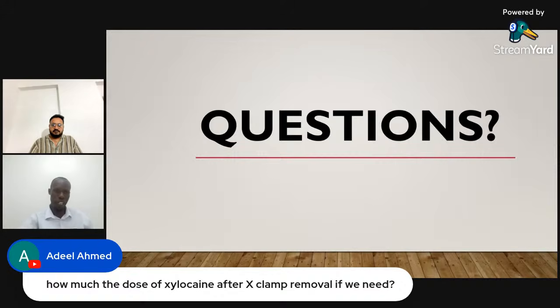Maybe you can share, you've done this. Yeah, some centers use it. Maybe you have a different protocol, but I use Xylocard after we release the clamp. It is to stabilize the myocardium, if there is any heart block. So we'll go to the next.